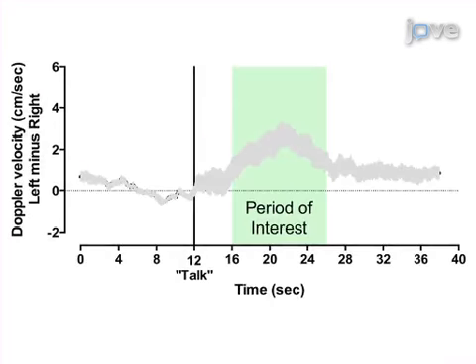The final step of the procedure is to examine the difference in left and right activations to extract a laterality index. Positive values indicate left lateralization and negative values indicate right lateralization. Ultimately, results can be obtained that can be used to compare brain lateralization in children at different ages or for groups with and without developmental disorders.